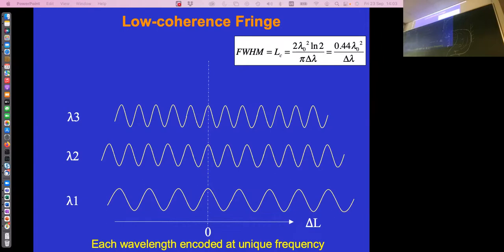So will your detector see that? Are there detectors fast enough to see hundreds of megahertz? Somewhere probably. It's getting there. Sorry, hundreds of gigahertz. Telecom is running at 5 gigahertz, so it's getting there. But you can immediately see that the interference between two different wavelengths is so fast that it's very hard to see. So what you can say is that the interference between two different wavelengths actually doesn't occur unless you have extremely fast detectors or you measure over very short time scales.